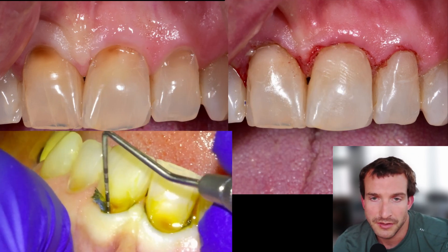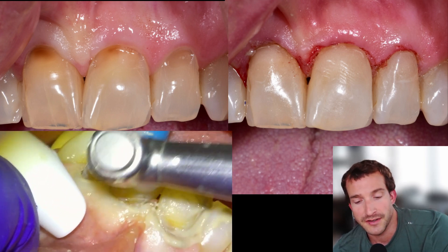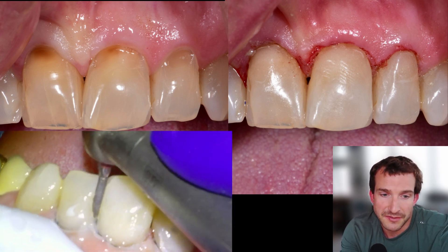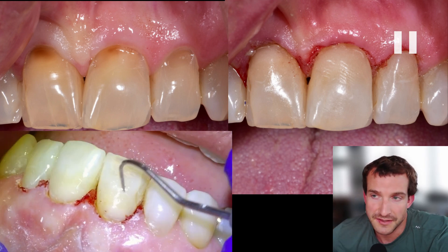Hey guys, Dr. Dobson here. I'm going to be doing some no-prep Class 5 restorations for aesthetics. This is a patient we saw at an exam — we looked at the front teeth and said we can make these things look nicer if you want without using a drill, and they said sure, let's do it.